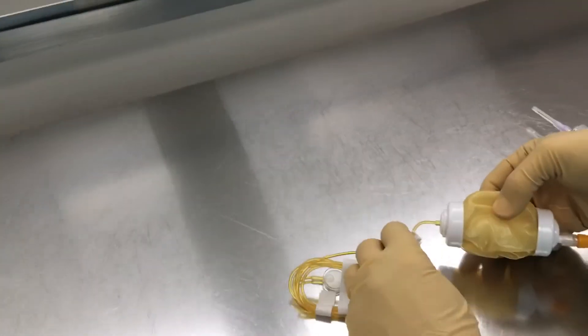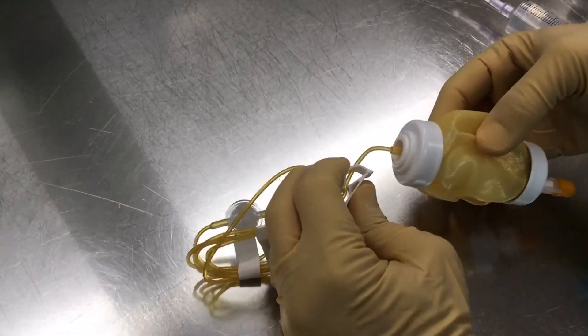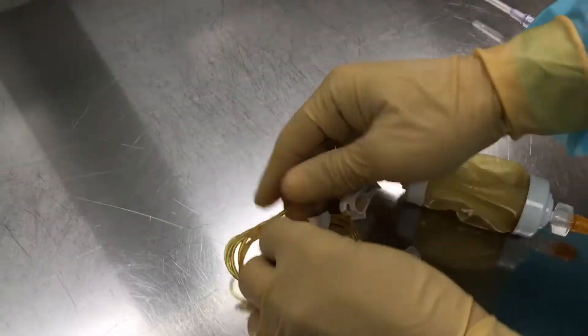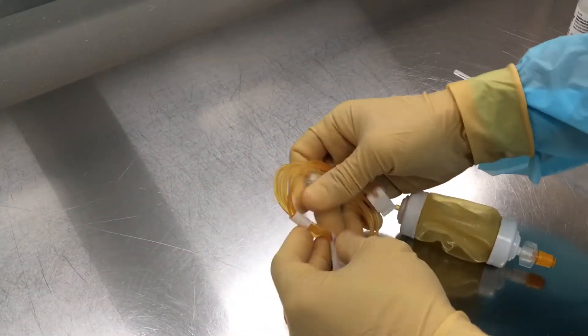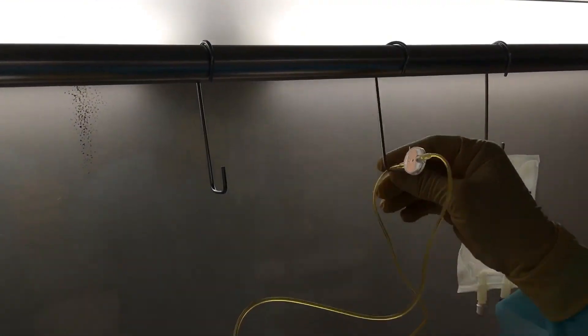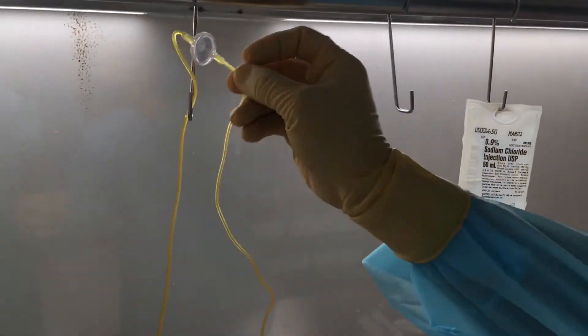Step one: we're going to prepare the tubing by clamping and untangling it. This little air filter must be positioned above the level of the pump, so the best way to do it is to hang it on the rod inside the hood. There you go.